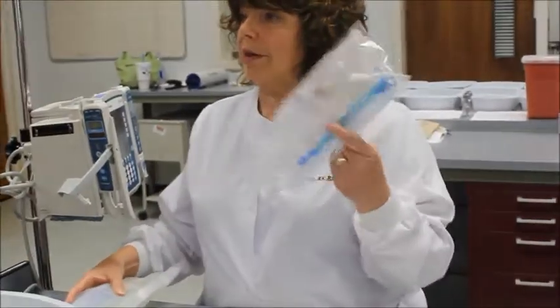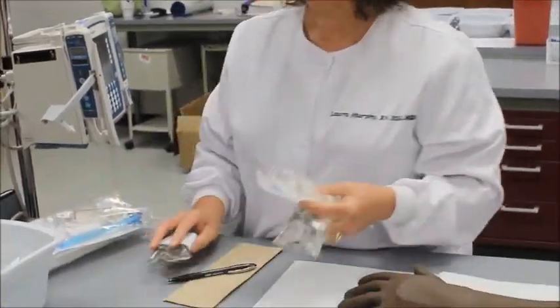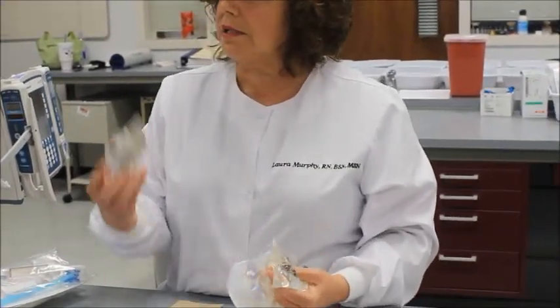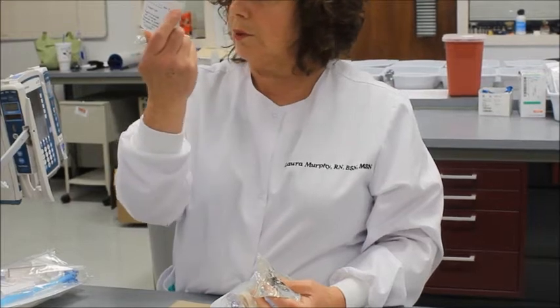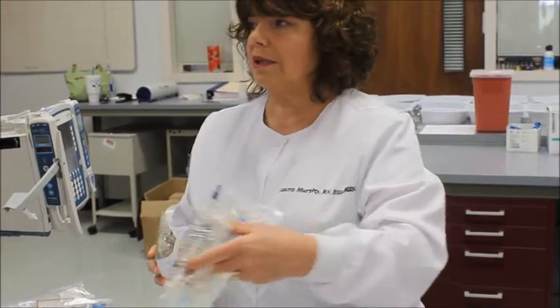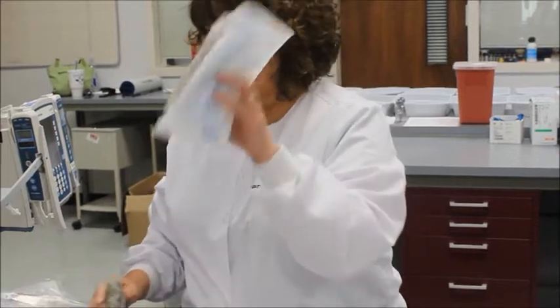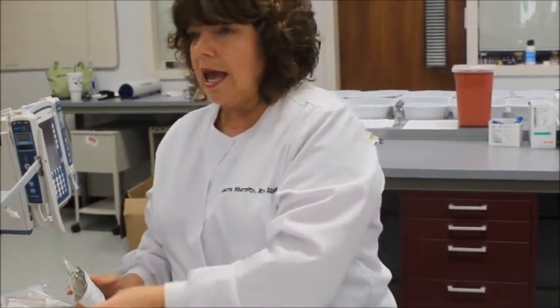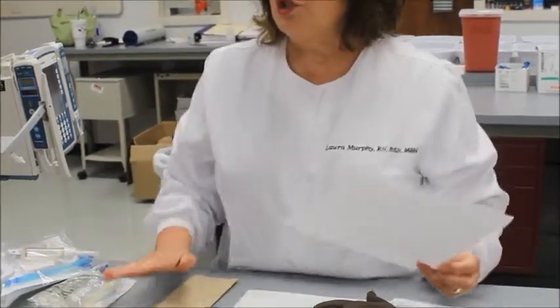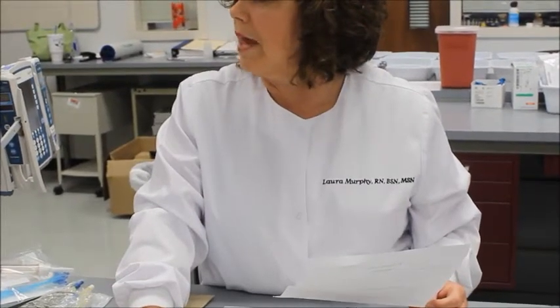I will need a primary line. Okay. I'm going to go ahead and get my secondary line, and since they sent up my medicine very quickly, I'm going to get it. Now guys, I'm going to start one that's not labeled, just because I don't want to use y'all's supplies. Okay? All right, so here's my secondary oxacillin and that medication. Okay? All right. To know how to start your secondary, you are going to have to do a math problem.